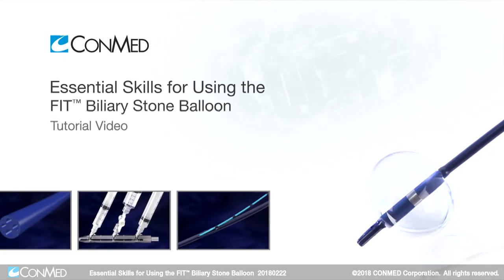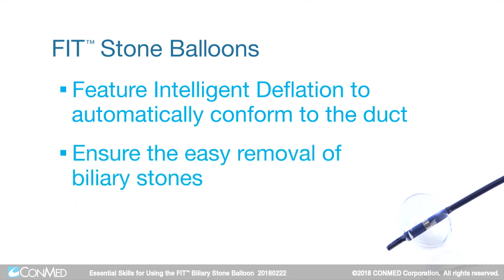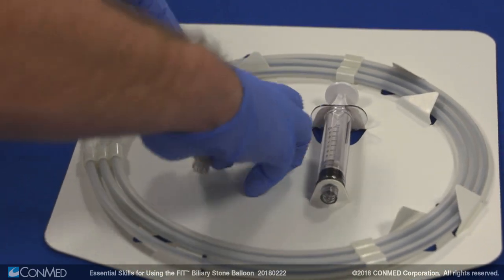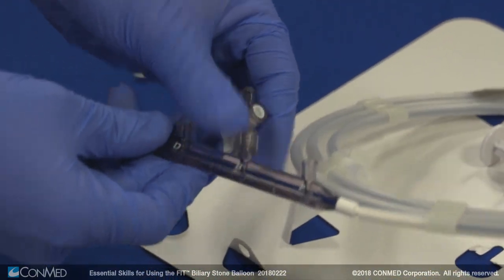ConMed Fit Stone Balloons feature intelligent deflation to automatically conform to the duct, which ensures the easy removal of biliary stones. To begin setup, remove Fit from its pouch. Then, remove the stopcock and attach it to the lure lock on the middle injection port labeled B.